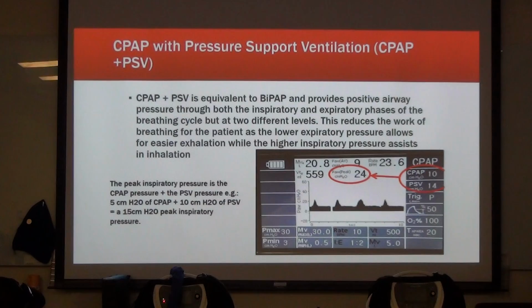So if they gave you 24/10, which means peak paw pressure is 24, CPAP or PEEP pressure is 10, subtract 10 from 24 and you put 14 right here. 14 and 10 give you 24. You're going to have to do that, okay? Because it's wanting to know what you want a steady pressure at, and when it triggers, what the pressure is going to go to.